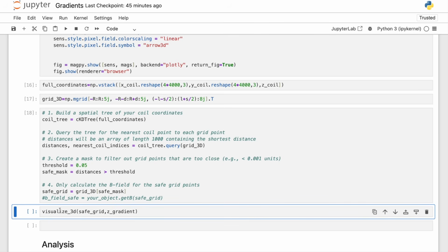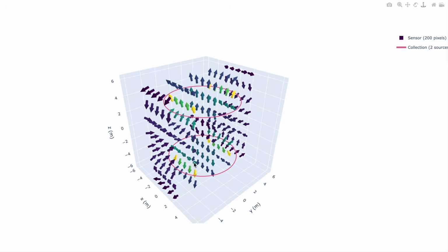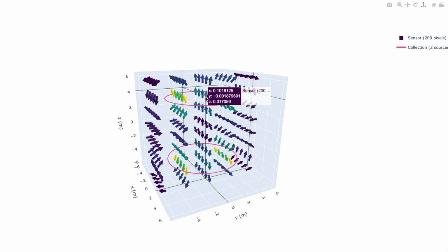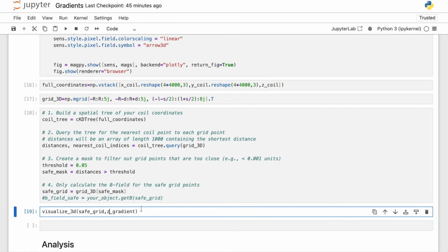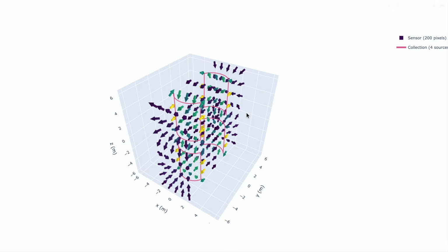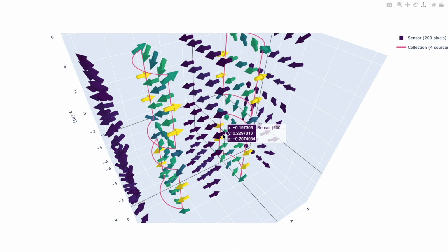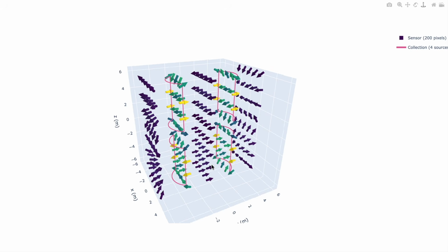And here I will use my visualize 3D function for Z gradient. So here we see the field is increasing with increasing Z. Here it's additive, here it's subtractive, as we were expecting. Let's run it for Y. So again, we see the result we expected. It's changing in the Y direction.